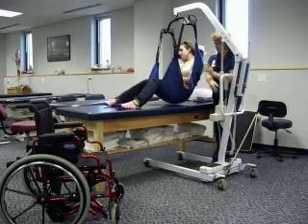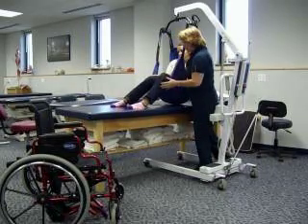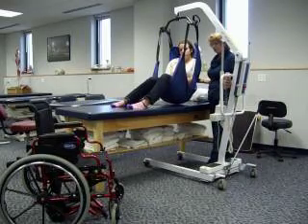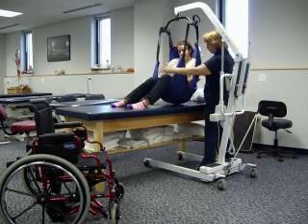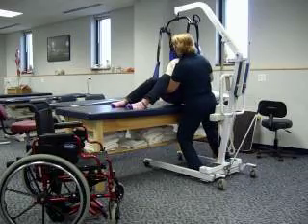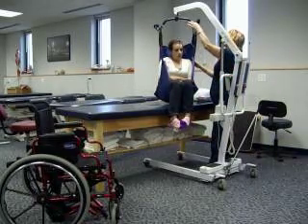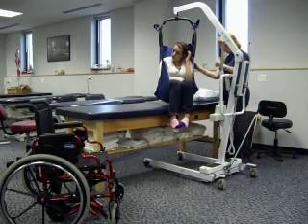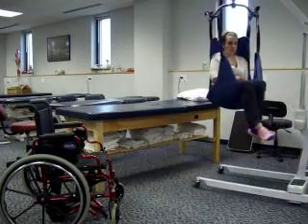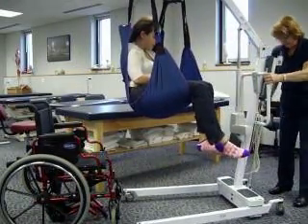I want to make sure we don't have a lot of wrinkles underneath because this sling will stay under her in the wheelchair. Is everything comfortable so far? I don't see a lot of wrinkles — we look pretty good. I'm going to raise you up a little bit more. Now I'm going to turn you, and when I do, as your feet come off the table you're going to lean forward just a little bit — that's okay, that's all part of it, you're still well supported. Before I take her off the table completely, I'm just double-checking all of my safety latches — they look good. You may have to use your hip, your knee, whatever you need to get this thing to move, especially on carpeting.